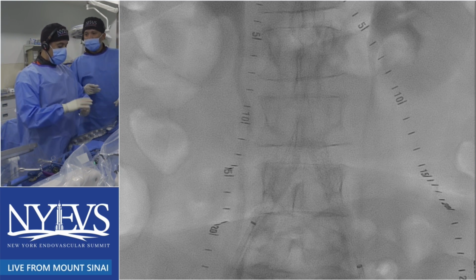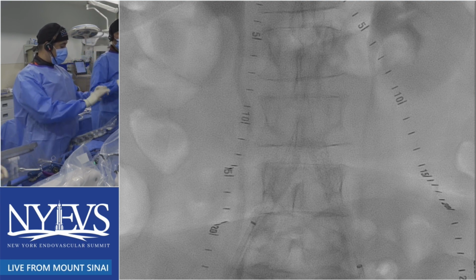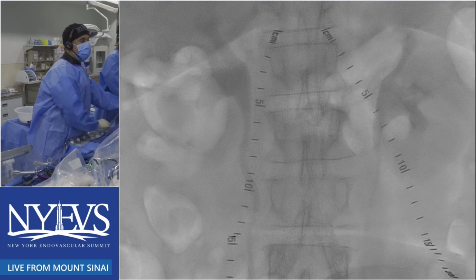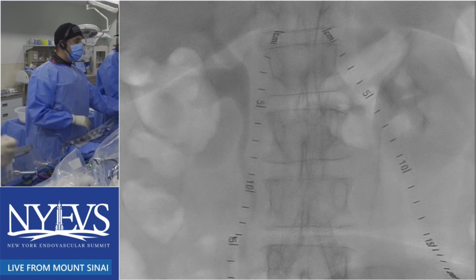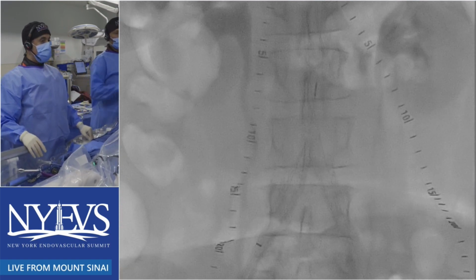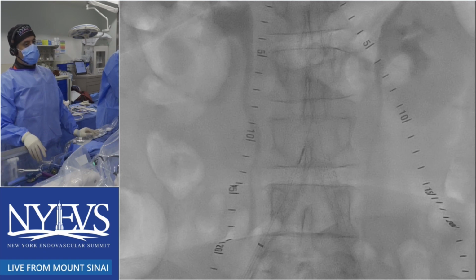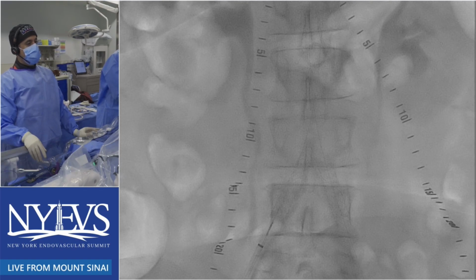The absence of a gradient doesn't mean that nothing is wrong. It just means that in this setting there isn't a difference. But I wonder in situations like that whether you might not even be able to induce a gradient. I think the real issue is you've got to make sure anatomically you have good inflow and good outflow. Having a flap in there that is moving around is going to be a problem long term too. Vishal, I think Kingsport is live, so we're going to switch to them and come back to you.